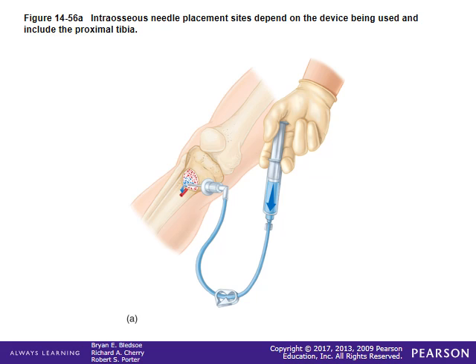It is also done with drills in the humerus of the adult, but intraosseous injections are done mostly on kids, and the medial tibia is one of the most desirable sites.